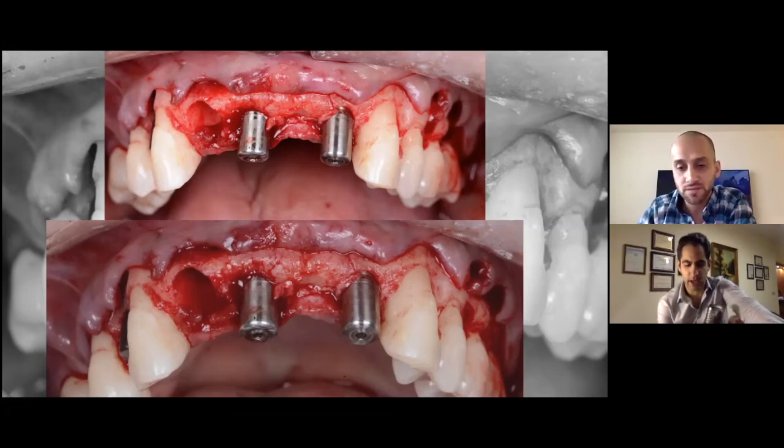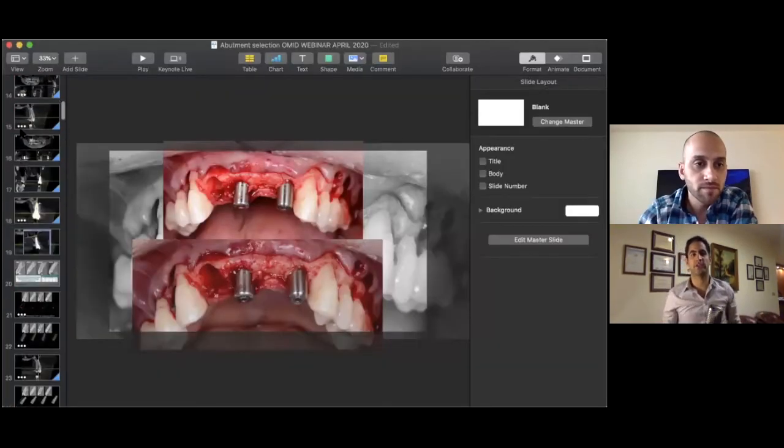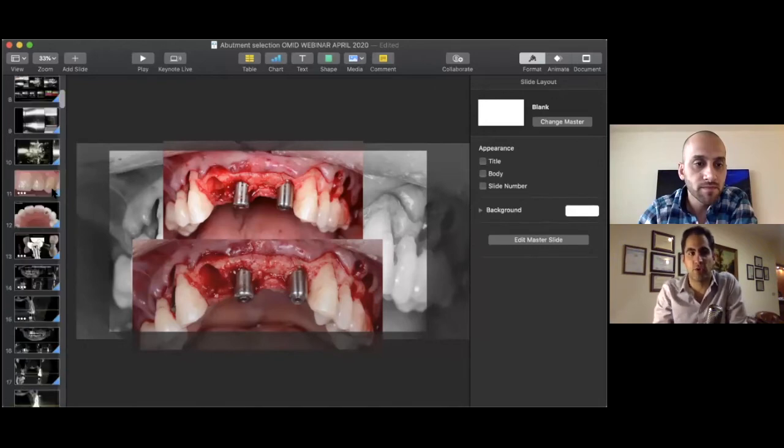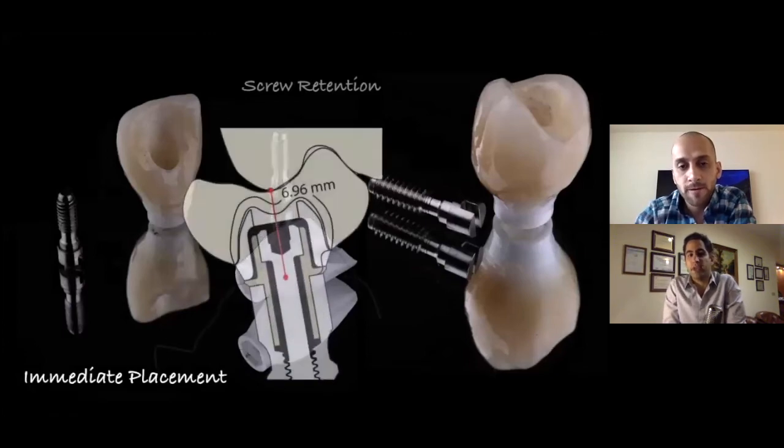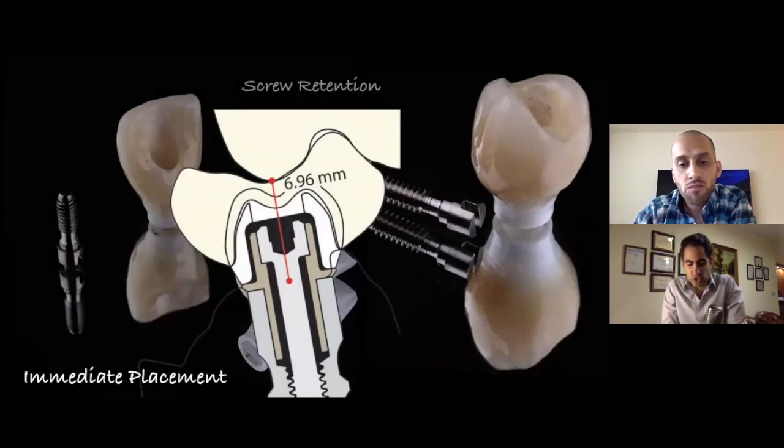And one of the things you also mentioned at the beginning of the presentation was the interocclusal limits for screw retained crowns. You mentioned that with 6 millimeters of interocclusal height you go with the screw retained restorations and there won't be any problem. So one of my concerns, just as a question, on that slide: if we have a space like 6 millimeters, is it okay for the lab technician to cover that screw access hole? For example, with a PFM crown or a screw-retained crown with a titanium abutment.